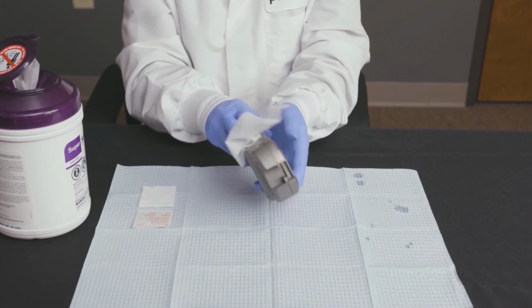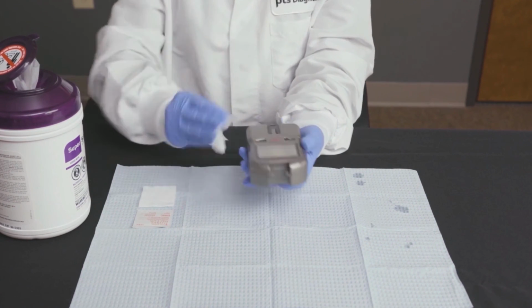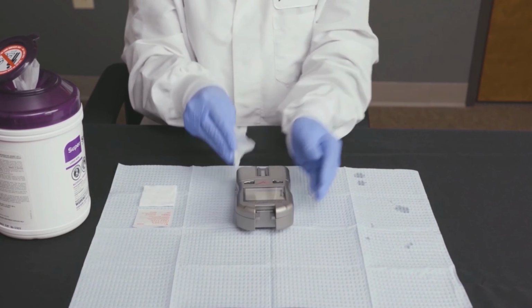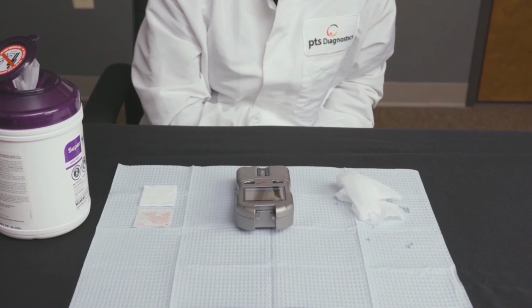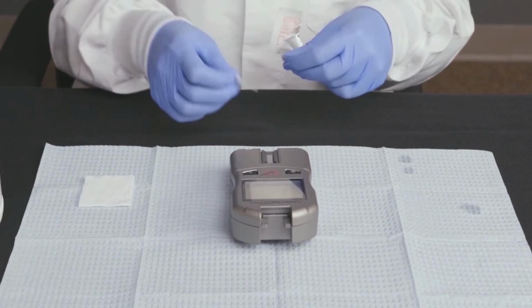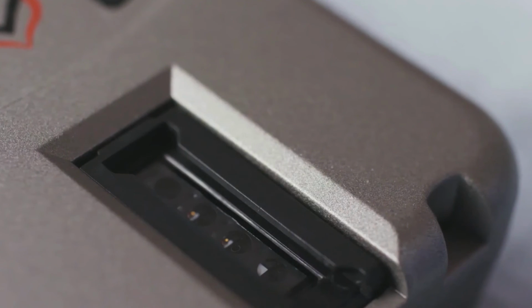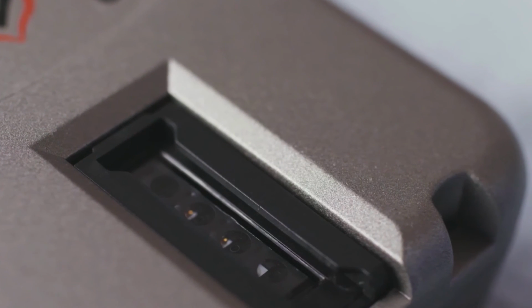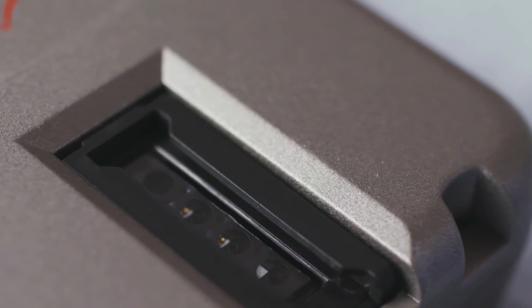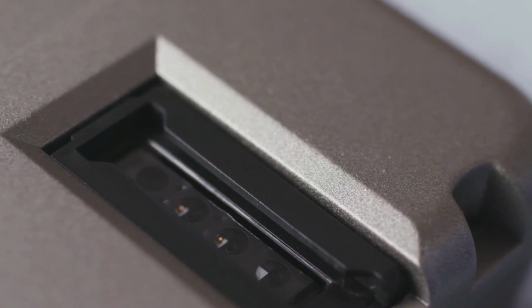Keep the surfaces of the analyzer damp with disinfectant for 2 minutes. This is long enough to kill blood-borne pathogens. Once the necessary disinfectant contact time is up, allow the device to air dry completely. Clean the optical glass with an alcohol wipe to remove any residue left behind by the disinfectant. Dry with gauze. Inspect the optical glass, holding it at different angles to make sure it is clean before running your next test, or before placing the analyzer in the case.